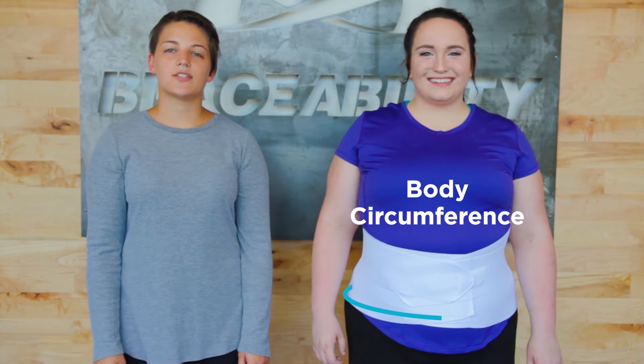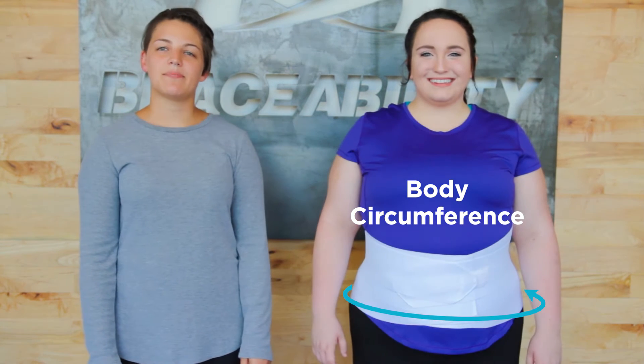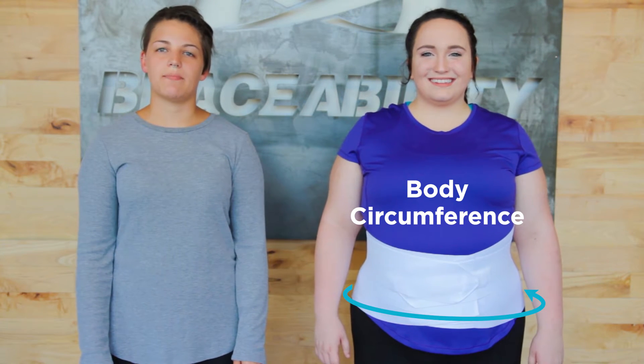Use this video to get the right size for your Braceability Low Back Support Brace. Make sure to always use a soft, flexible measuring tape. The circumference that you are wanting to find is what we refer to as your body circumference. This is the widest part of your torso in which the brace will go around, and it typically falls between your waist and your hip bone.